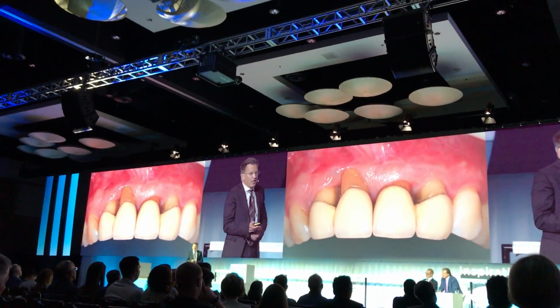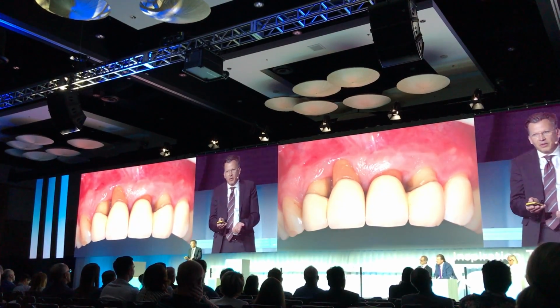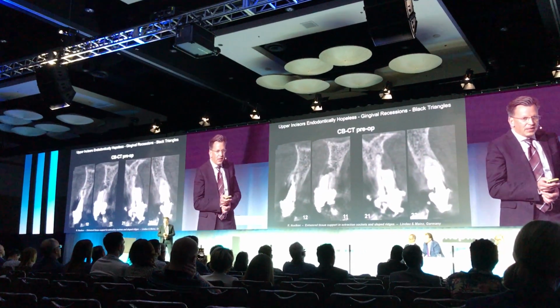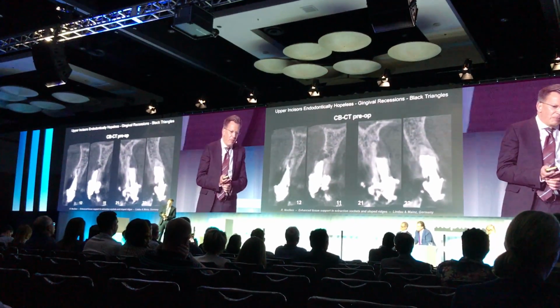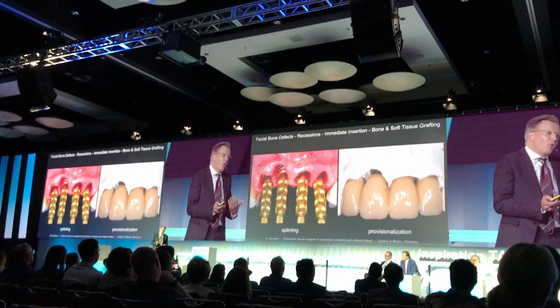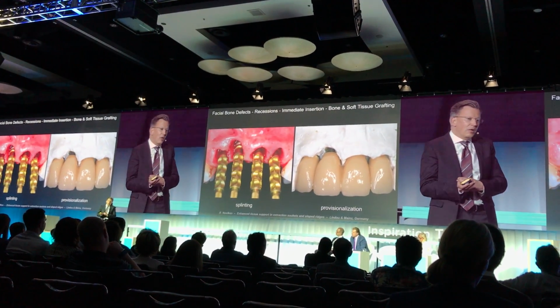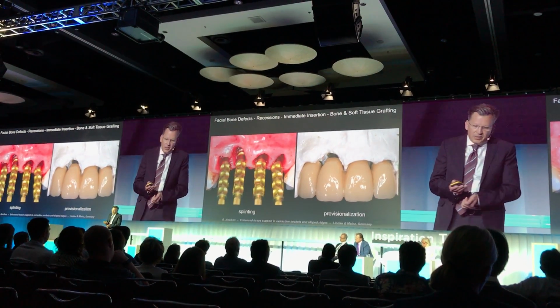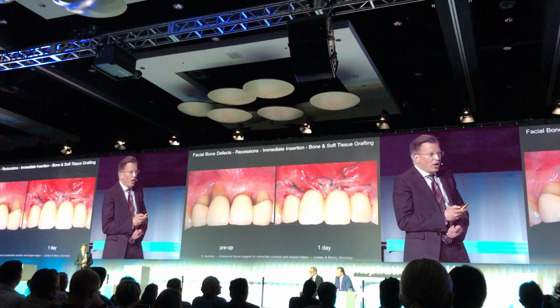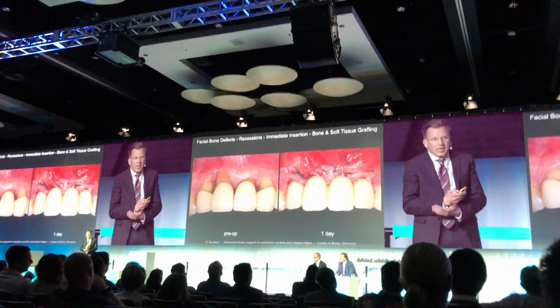So, can we apply this technique also when we have multiple recessions neighboring each other? You can imagine what is underneath there. The teeth were hopeless due to insufficient apicoectomies, and we removed all the teeth and placed implants. Important is the right alignment, vertical as well as orofacial alignment. You don't have to place your implants too deep. You want to create a tissue height.